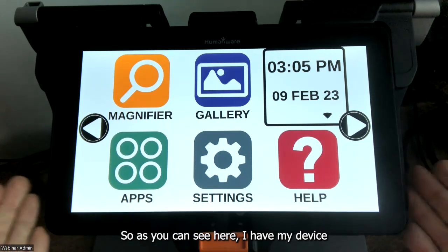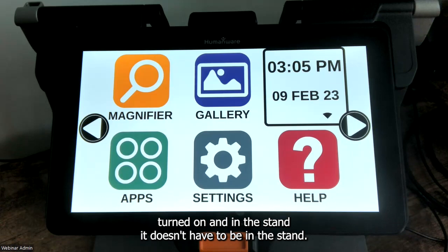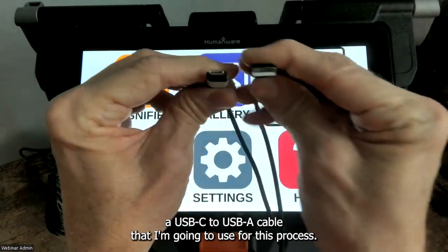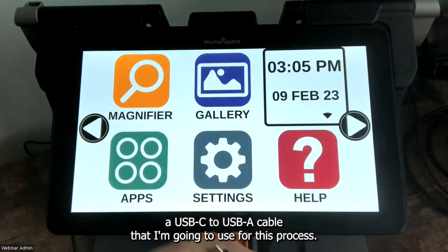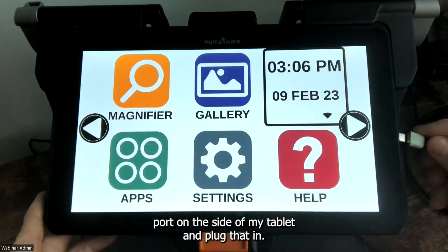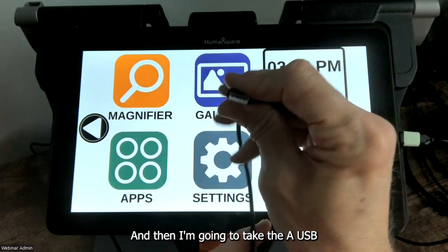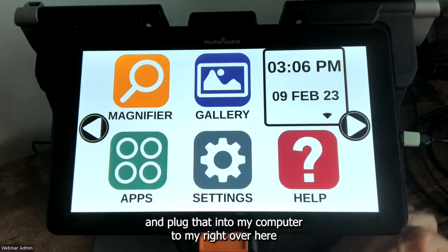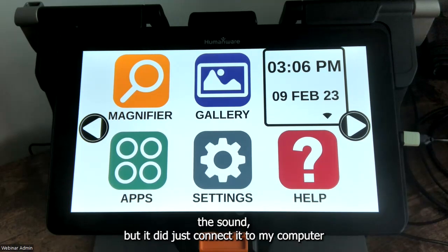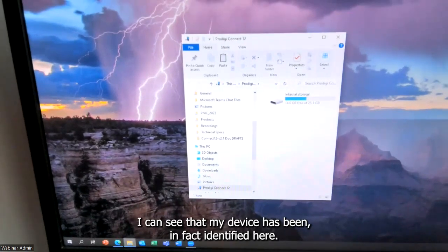I have my device turned on and in the stand — it doesn't have to be in the stand, it just happens that I have mine there. I have with me a USB-C to USB-A cable that I'm going to use for this process. I'll take the C end and plug it into the C port on the side of my tablet, then plug the USB-A end into my computer. It did just connect, and on my computer screen I can see that my device has been identified, showing the internal storage of my Connect device.